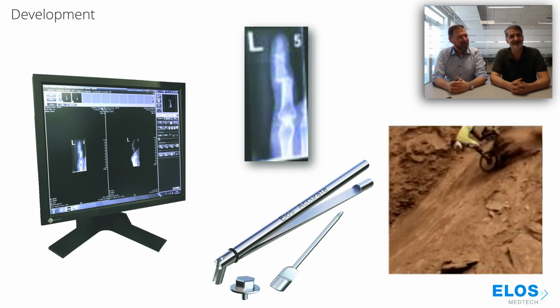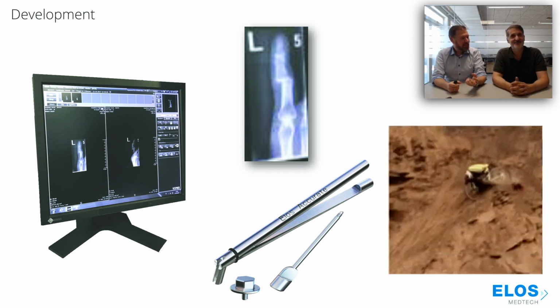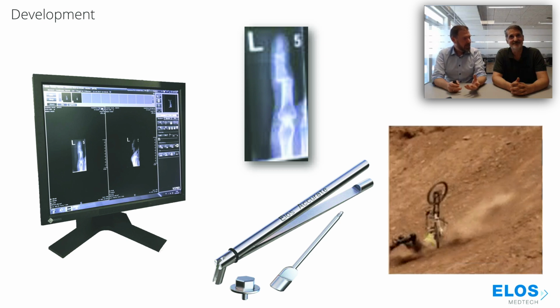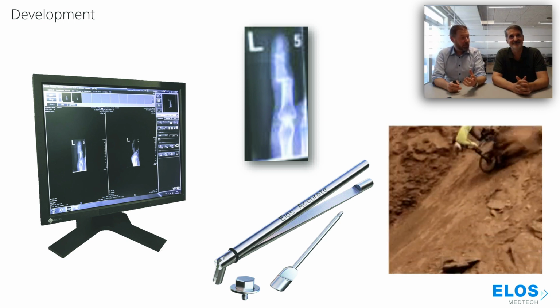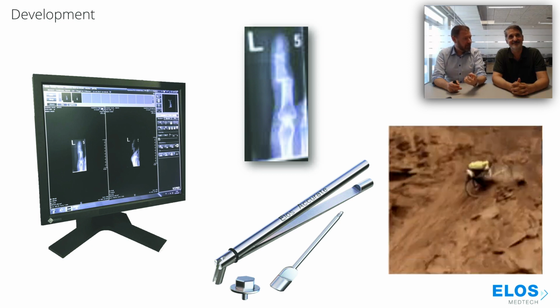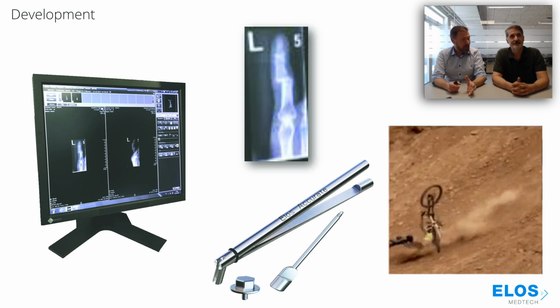And I find that funny, because it just goes to show that even though you can have a really nice and tight fit between the model and the PMA, it requires very little effort to install it. And the good thing about this tool is that it pulls the PMA into the right position, in the right angle, with very little effort.